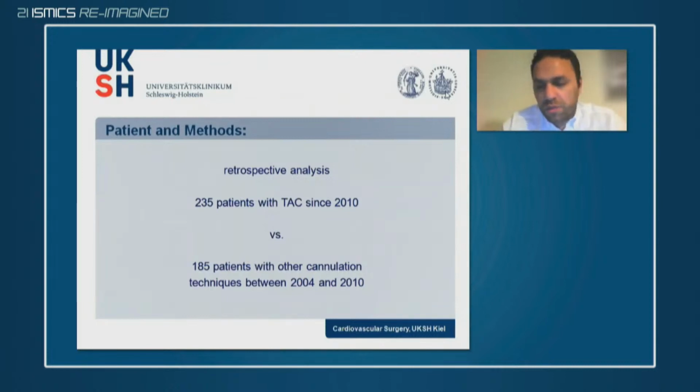We carried out a retrospective analysis with 235 patients with our cannulation technique since 2010 versus 185 patients with other cannulation techniques before 2010.